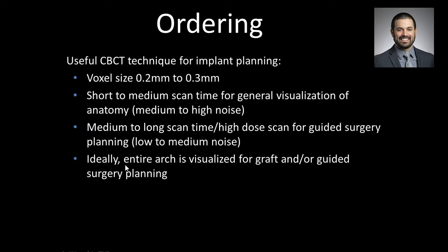Much of the time, I see practitioners imaging the entire arch. That kind of gives us a nice comprehensive arch evaluation, also identifies graft sites. And with that entire arch, you can many times get the best guide fit. That would be as opposed to a smaller 5x5 field of view where you're really zooming in on a single implant site.